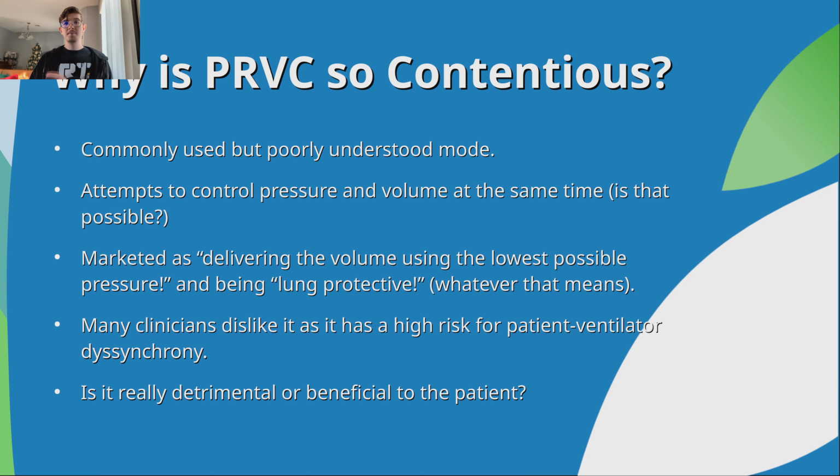It is often marketed as delivering the volume using the lowest possible pressure and being lung protective, whatever that means. But many clinicians dislike PRVC as it has a high risk for patient-ventilator dyssynchrony. Now here's the question. Is it really detrimental or beneficial to the patient? Well, we're going to get into that.